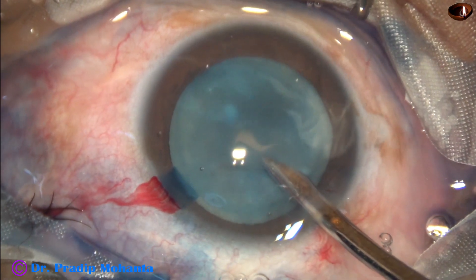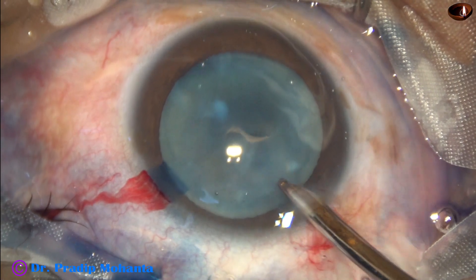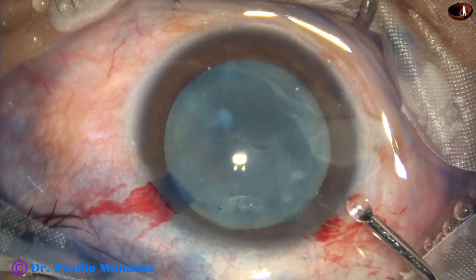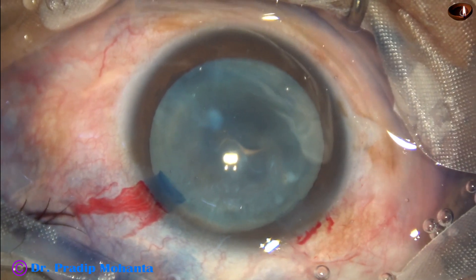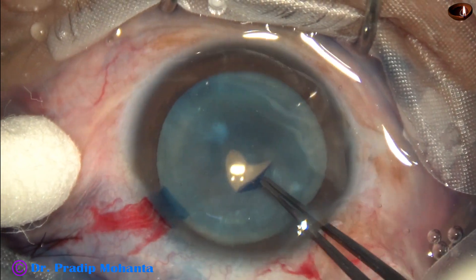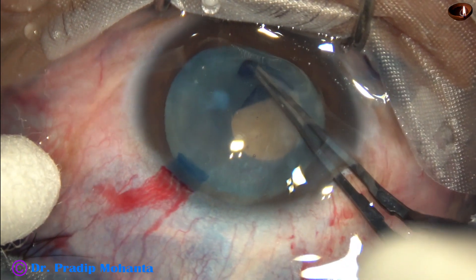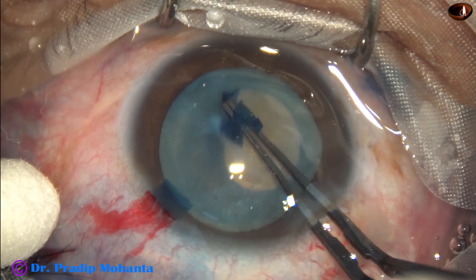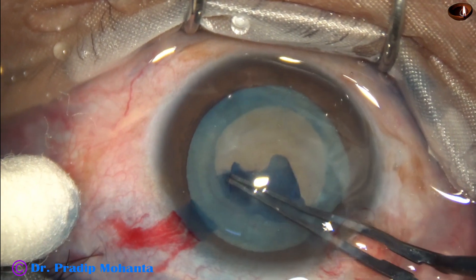In hypermature Morgagnian cataract it is not necessary to do a small rhexis. Just by puncturing, the milky fluid comes out and the intralenticular pressure reduces dramatically, and we can aspirate the milky fluid through this cleft. Now an adequate size capsulorhexis of about 5.25 millimeters is done with the help of utrata forceps.